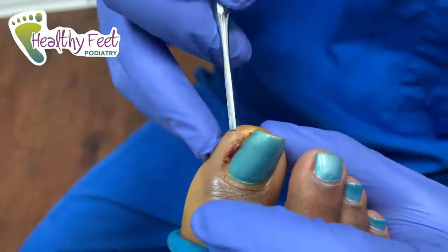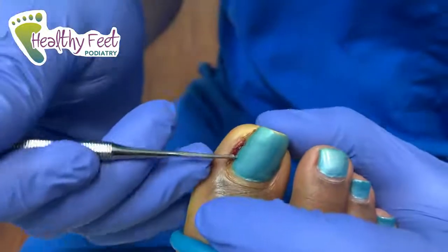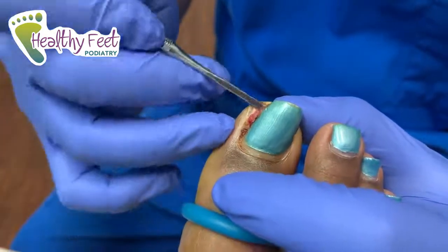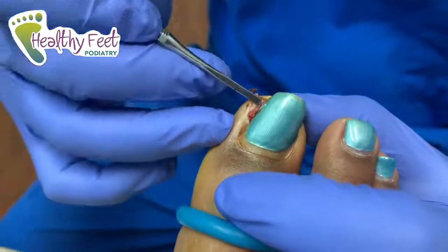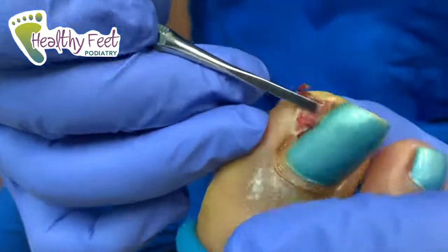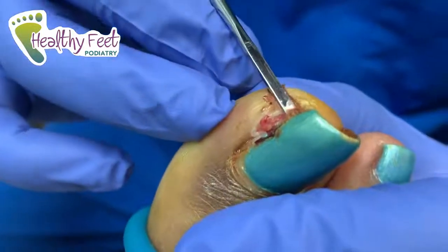So first things first, we're gonna get this crud out of the area. She said there was a bunch of pus earlier this week, and we might get some today. Are you numb yet? Oh, here you go. A little pus right there. A little pocket of pus.